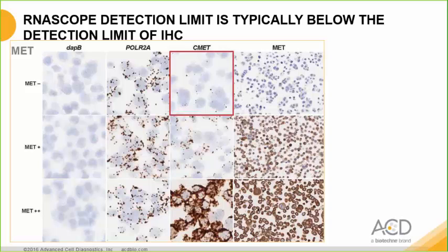The RNAscope detection limit is typically below the detection limit for IHC. These are images from 3 different MET cell lines, the first 3 columns of which have been stained with RNAscope probes, DapB, a negative control marker, Polr2A, a positive control marker, both of which we will discuss later, and cMET. The rightmost column is MET IHC. The low-expressing MET cells in the top row are negative for MET by IHC.